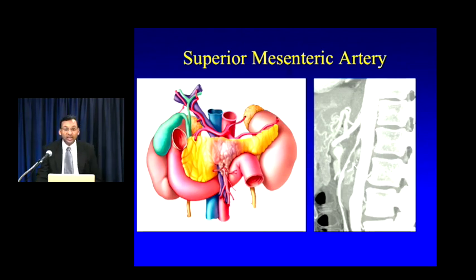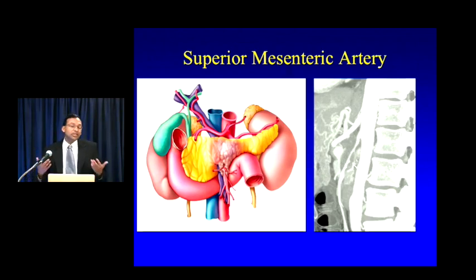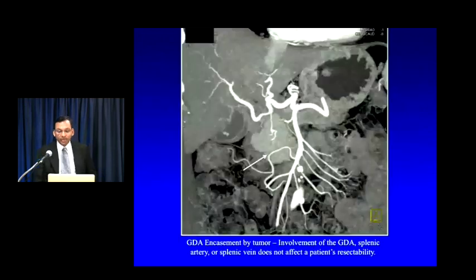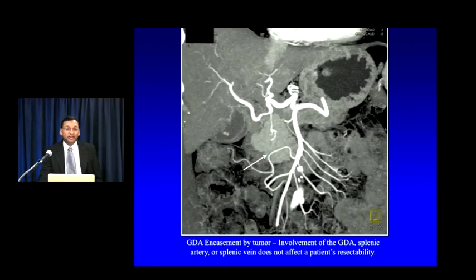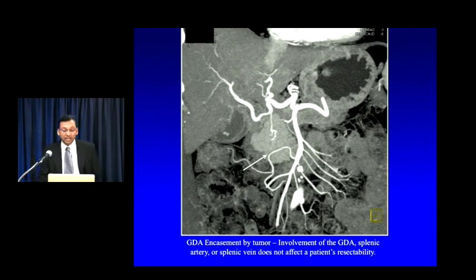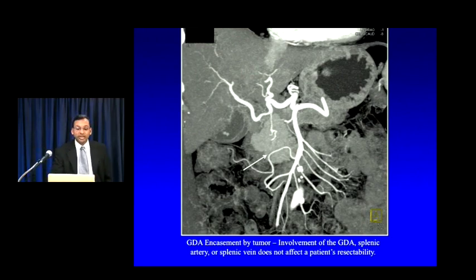Remember that other vessels don't matter so much — concentrate on those five vessels. Smaller vessels like the GDA are not a big deal. Here's an example where the GDA is actually encased by tumor, but that doesn't matter — the GDA comes out as part of the surgery and does not preclude resection.